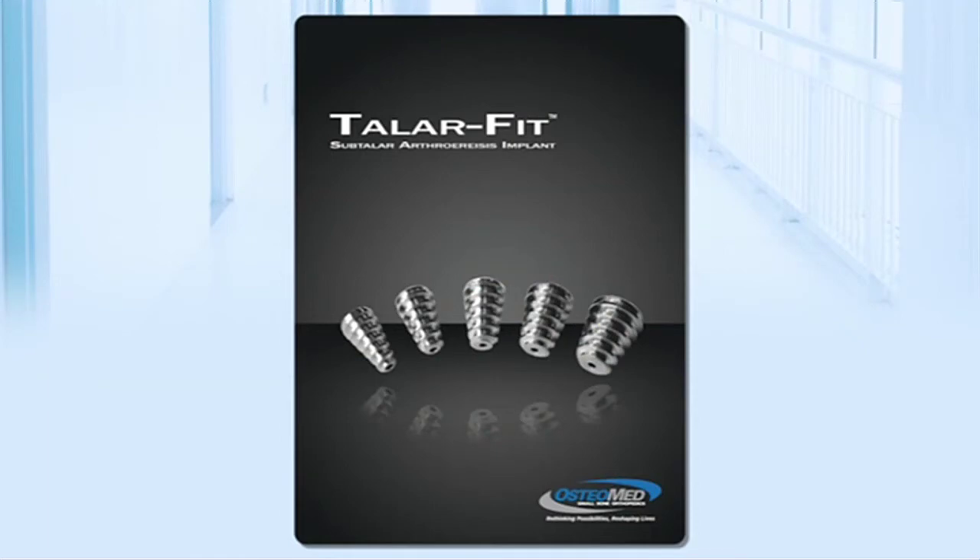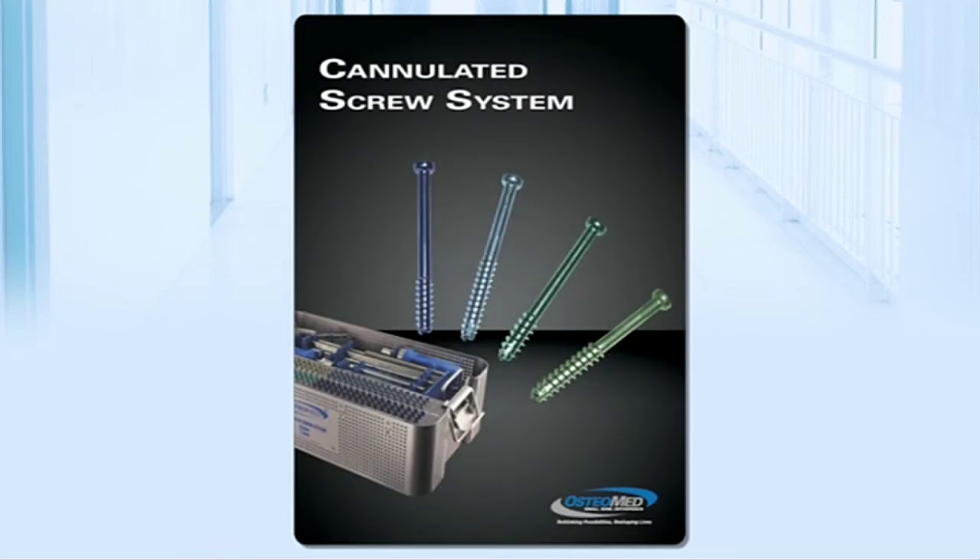First, TaylorFit features an anatomically shaped implant intended to provide superior blockage of the talus and prevent implant extrusion. Next, the large cannulated screw system features a comprehensive implant and instrument offering to accommodate a variety of surgical procedures.